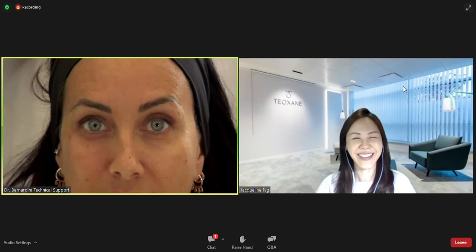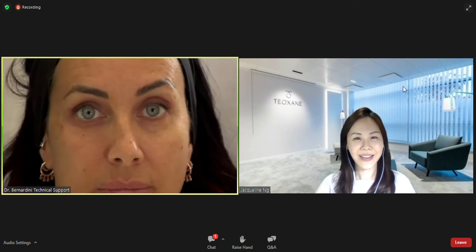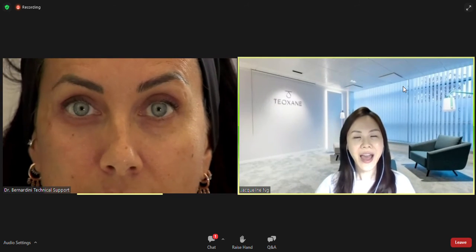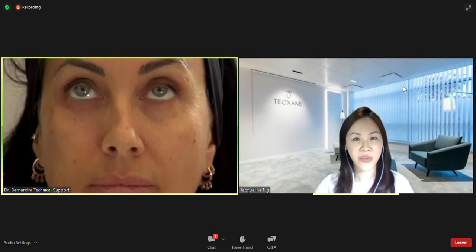Yeah, give me a big zoom. Senza sorridere neanche proprio uno. Abbiamo una difficoltosa luce, però. Okay. So Dr. Bernardini, yes, I can see, we can tell the results are very significant.